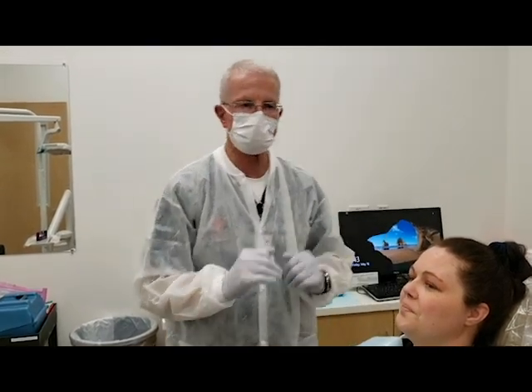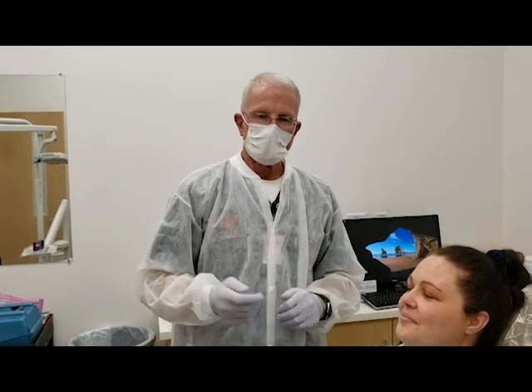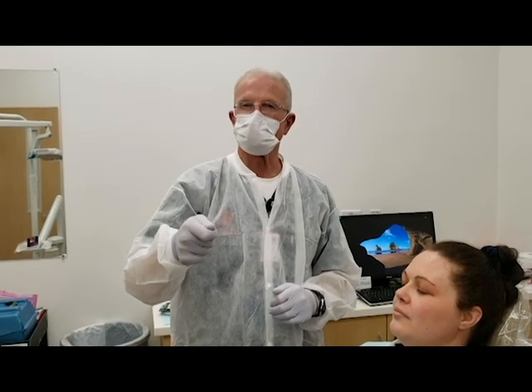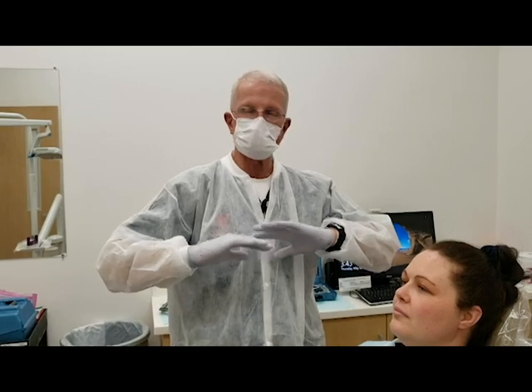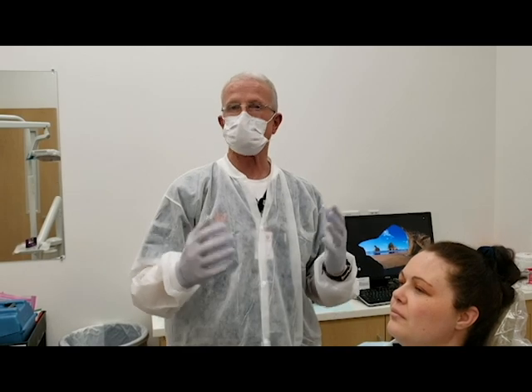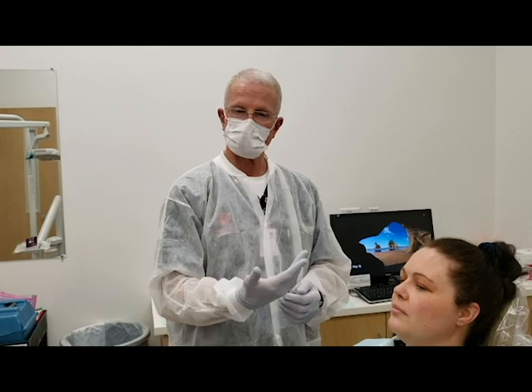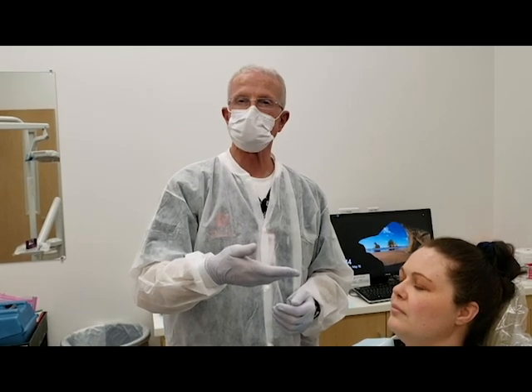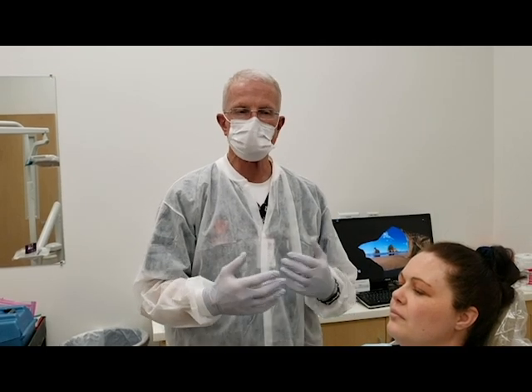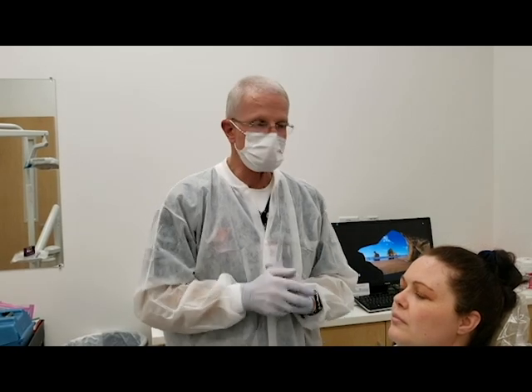I'm going to show you an alternate method of inserting an upper tray. If you insert it from front to back, you can capture all that anatomy up above the front teeth, which is critical on many aesthetic cases. The reason you insert from back to front is to keep the excess material from running down the patient's throat. But you can accomplish the same thing by the way you insert the tray from front to back.